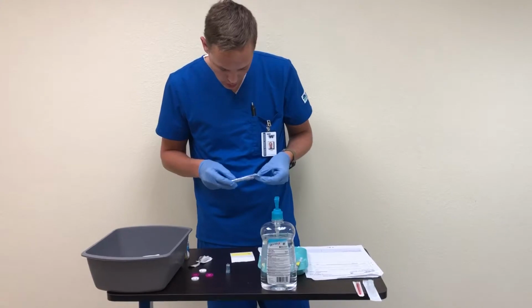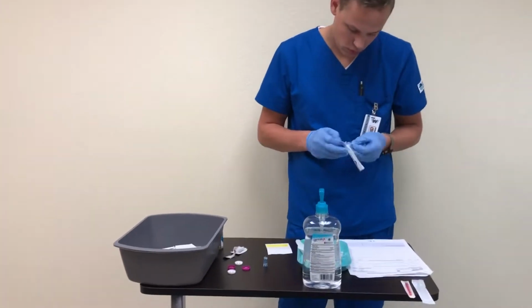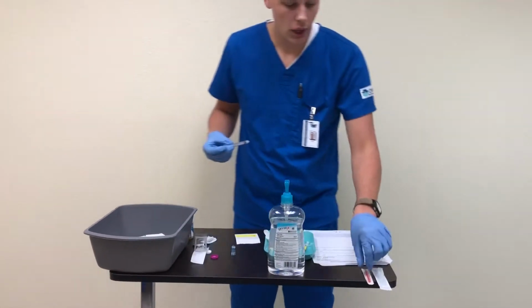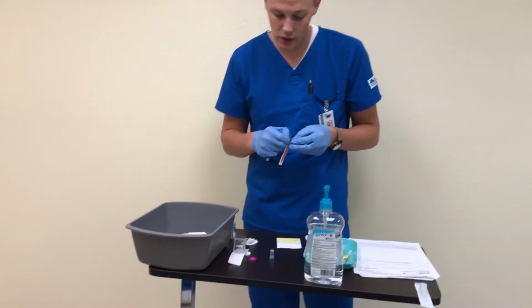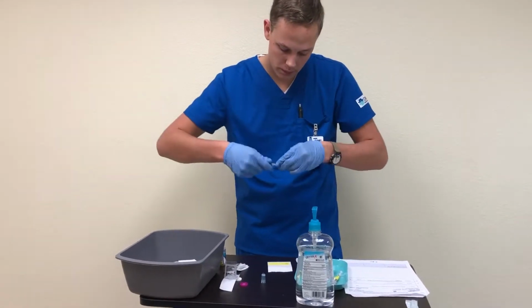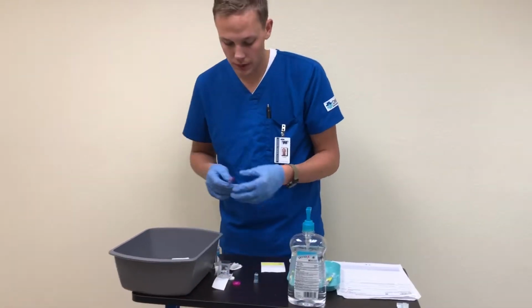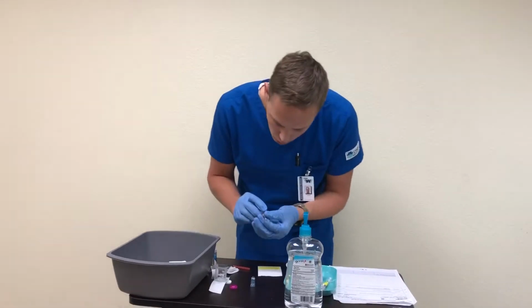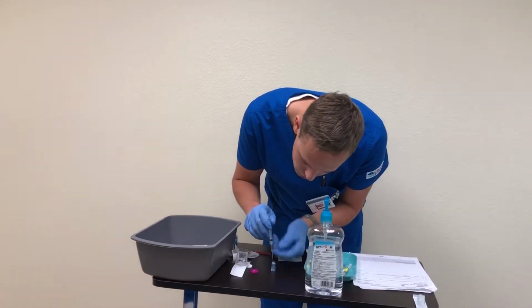So this is a 3 ml syringe, Luer lock, and then this is a filtered needle, and the filtered needle is needed in case any glass shards got into the ampule, that it is big enough and it has mesh in there that'll filter out any particles of glass. So again, I'll just uncap it, and we'll just be withdrawing half, 0.5 mils.